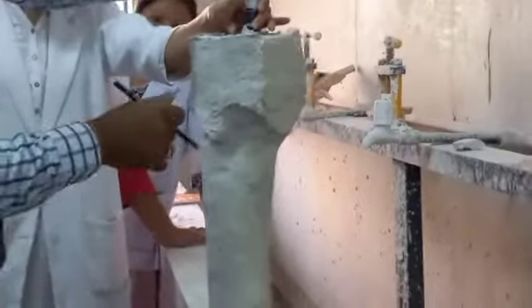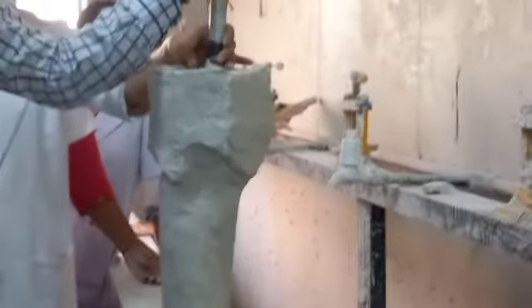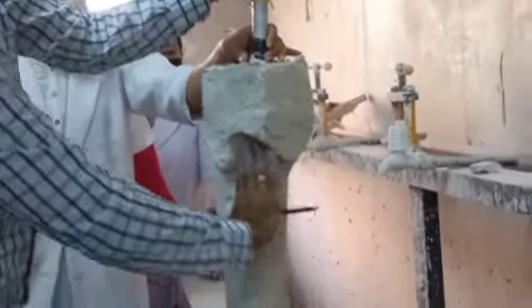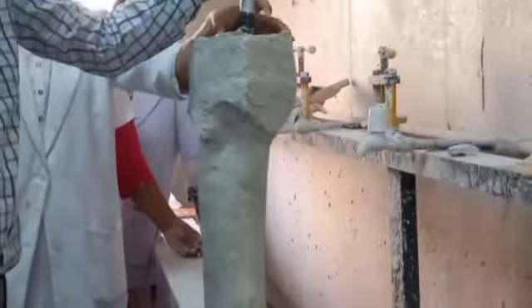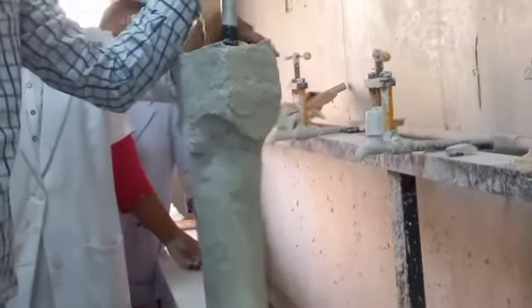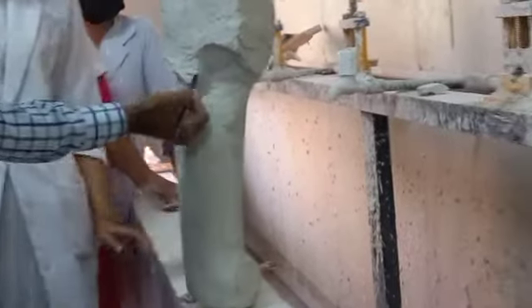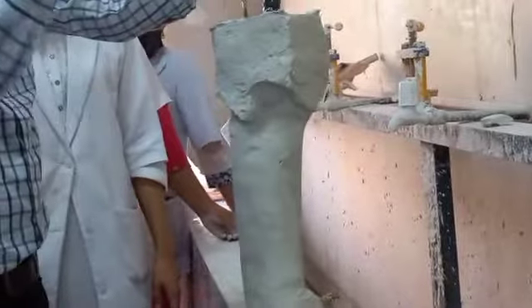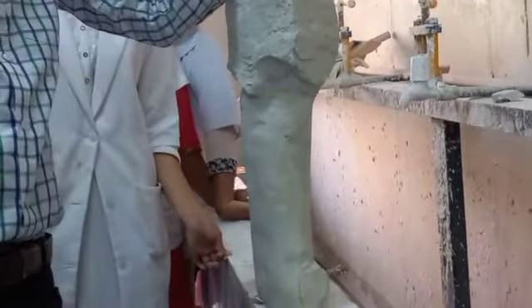And see, we are not doing anything in this area where we have used our fingers to give pressure or do the containment. We are not doing anything to it, just giving the border lines and smoothing it. We do not want to reduce it further, nor do we want to add any material. We are just giving the trim lines and adding at the distal point, the point that the anterior person was feeling. That point, if we can really mark it.